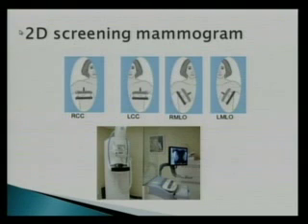The bottom picture shows what just a general screening, just any mammography tower is going to look like. Obviously, we don't have a lot of radiation, so they just have this thin lead. The walls don't have to have lead in mammography. And this is what the breast is positioned like.